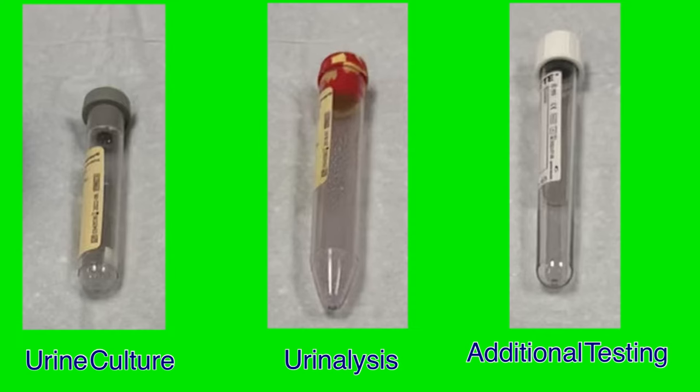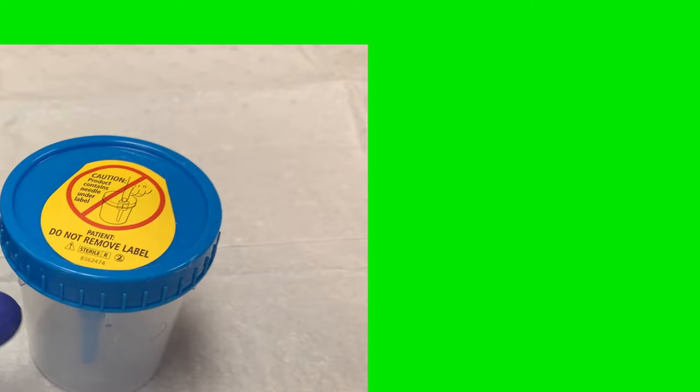Anytime you are collecting a urine sample for either a urinalysis or a urine culture, you should collect urine in all three tubes and send them to lab. This is required for a couple of reasons. First, there is a history of samples being collected in the incorrect tube. Many patients do not create a lot of urine, so it could take another day or more before the proper sample can be collected, which is detrimental to patient care. Additionally, orders are often placed for one test, and the remaining test is quickly ordered afterward. If the lab already has the urine in the appropriate tube, they can quickly run the test without needing another sample.